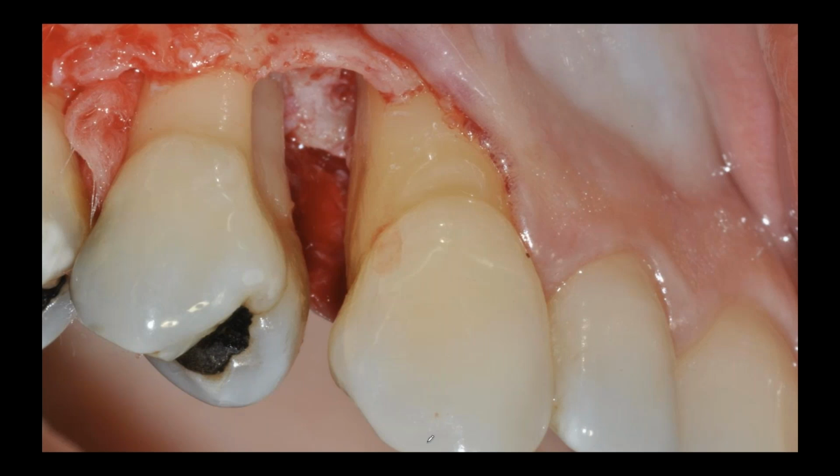highlighted a little bit. Technically and classically, we've been taught to treat a defect like this most of the times by removing this portion of bone and creating a sort of ramp. So by ramping palatally, we kind of remove the pockets. This is very much a pocket eradication. Therefore, the aim of the surgery is very different from the pocket closure that we talked about before. This is a treatment that is absolutely effective when you remove a bit of tissue in order to achieve your final outcome, which is a very shallow pocket. In order not to compromise aesthetics, most of the times, as I said, the ramping is done on the palatal component so that there is no aesthetical impairment on the buccal side, the visual side.